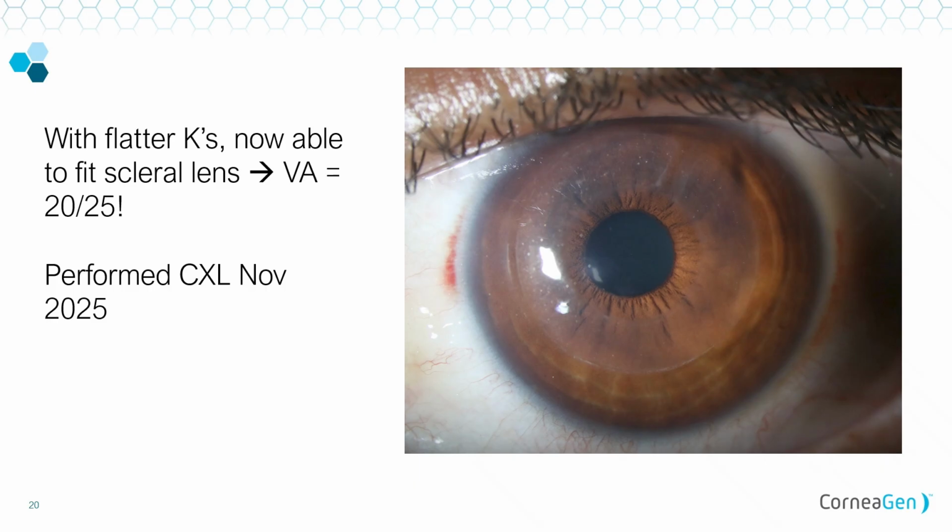This is the inlay. This is her 2 months later. And this is what we achieved. 12 diopters of flattening, but importantly, our astigmatism is much more orthogonal. And now we're going into cataract surgery, right? What did I do next? High-powered toric IOL, 20/30 uncorrected. And so this was never accessible to her again. So she went from not using this eye to walking around 20/30 uncorrected. She's a physician, an ER doc that was using one eye to do procedures. And there she is now.